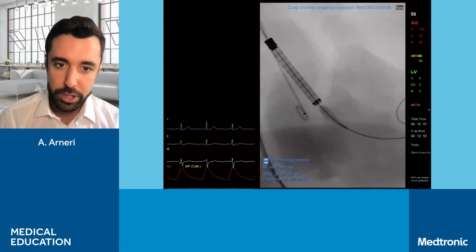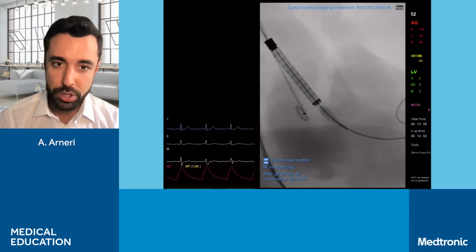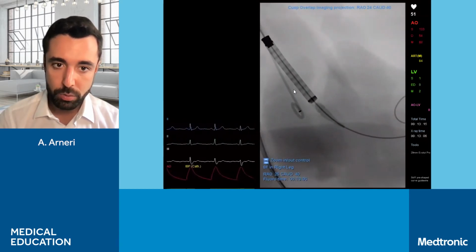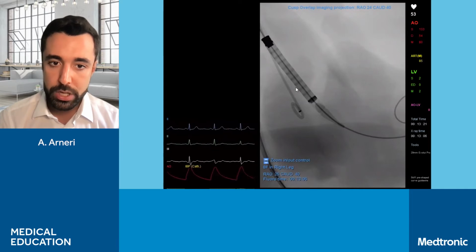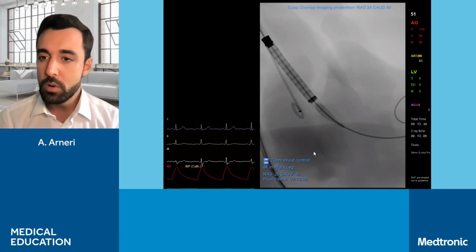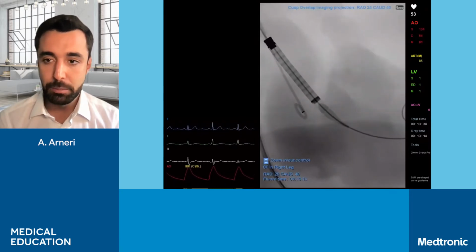And before starting that, George, what we have to keep in mind is that when we reach the third node with our radiopaque marker, we have to stop. Maybe, George, you can stop the image and show which is the third node. So if you start from below, we have node 1, node 2, and the white arrow now is pointing to the third node. When we reach the third node with the radiopaque marker, at that point we have to start a sort of controlled rapid pacing in order to avoid any unwanted movement of the valve during the implantation, and be sure to reach a really nice implant depth of 3 millimeter.